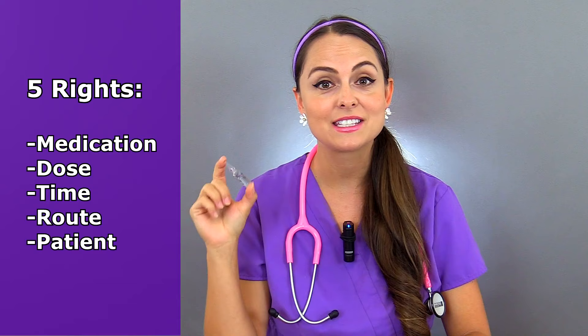You'll want to confirm that you have the right medication and it's the right dose, you're giving it at the right time via the right route to the right patient.